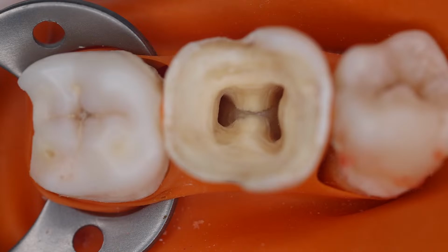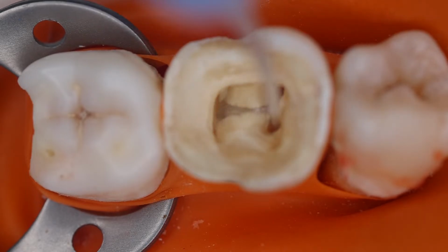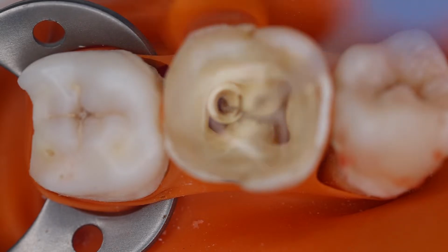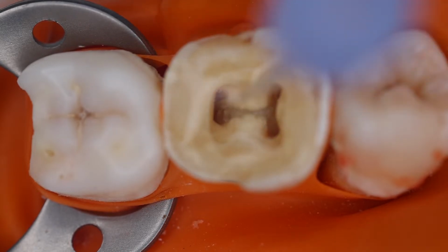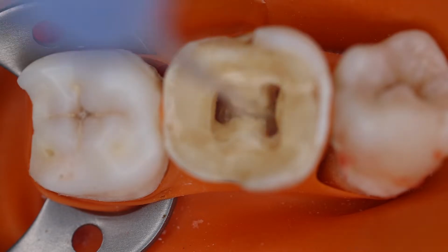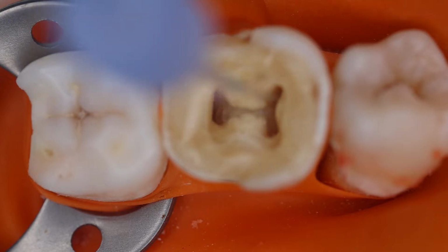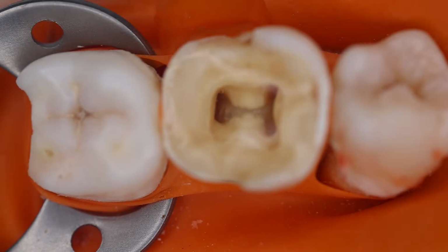Now once we have identified all these canals, this is the time we need to first irrigate these canals. You can use saline to flush out. Once you have entered any endodontic file, you must irrigate the canal. Flush out all the debris that has been accumulating.